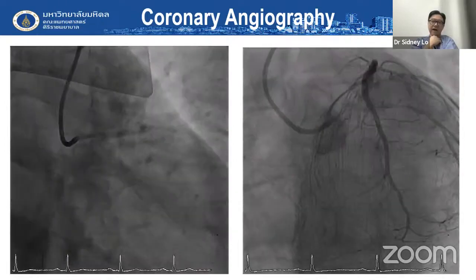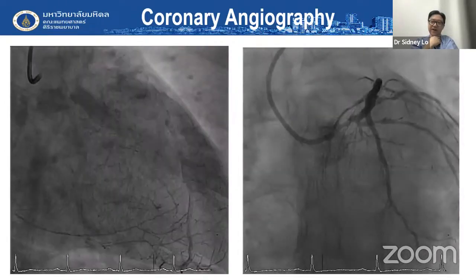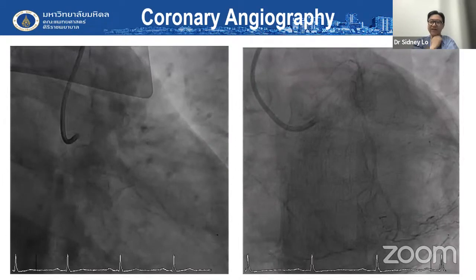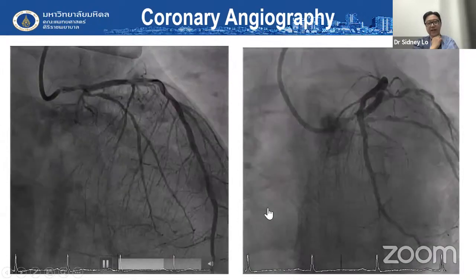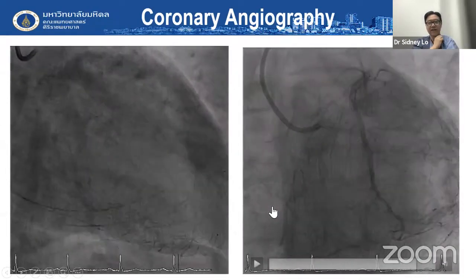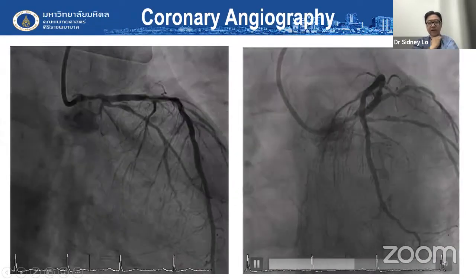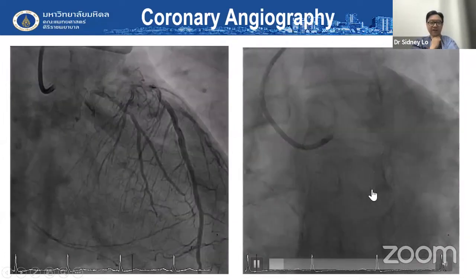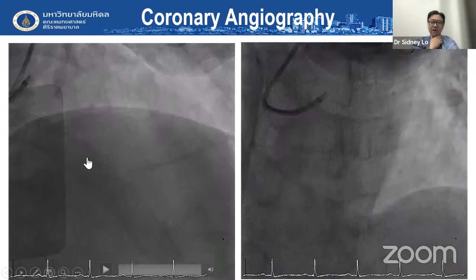Look, I agree with all the comments so far, and our surgeons are very strong here, so they would have taken the patient for bypass. But for PCI, if the patient refused, then I think the right coronary artery procedure is doable. But as to your question, whether you would do that before or after you've done the left main, and whether or not you would support the patient.